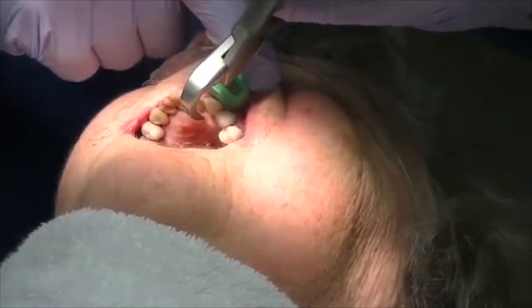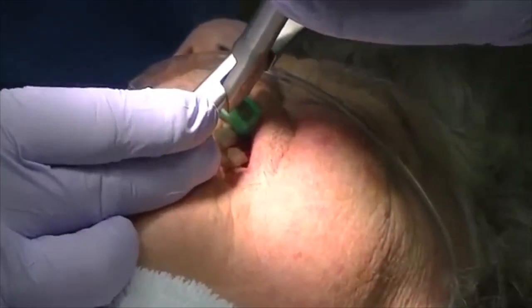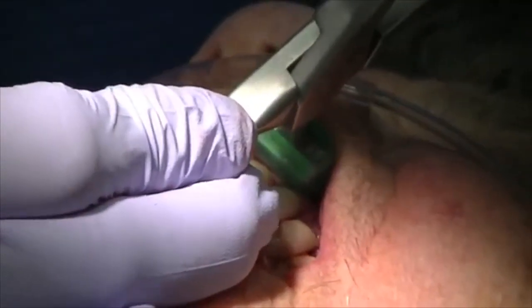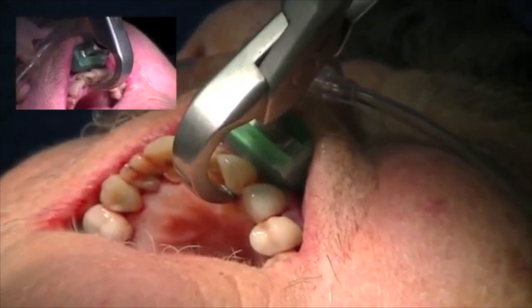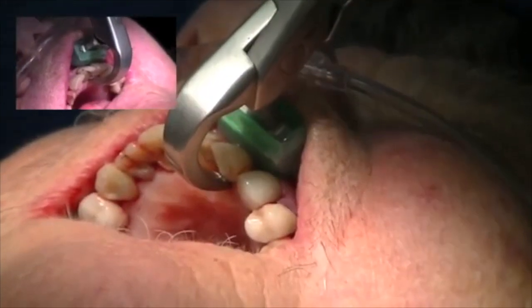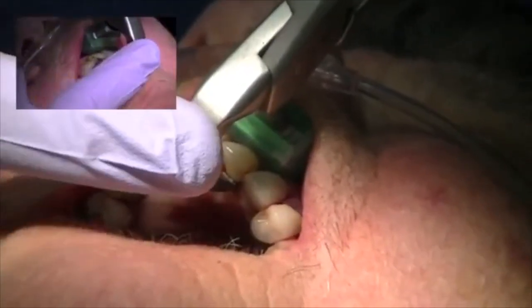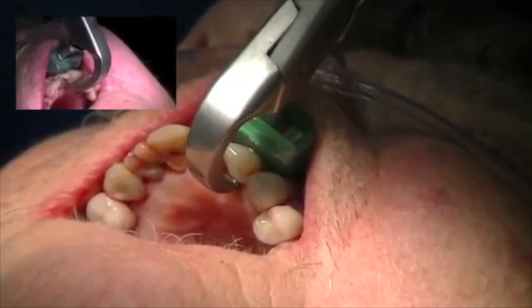Let's start with our lateral incisor. I'm going to engage the beak onto the palatal surface of the root. Now if you have an elliptical palatal surface, you may want to take a little surgical burr and flatten the root of the tooth — we're not removing bone, we're simply removing part of the tooth. I'm a right-handed dentist but I'm going to use my left hand. Can you scan out just a little bit? I just want to show you my hand position.